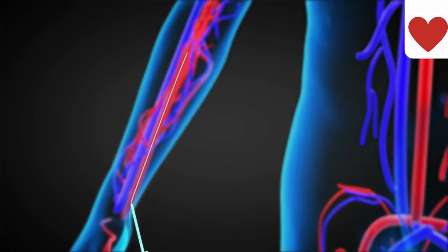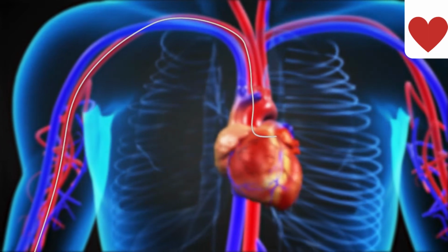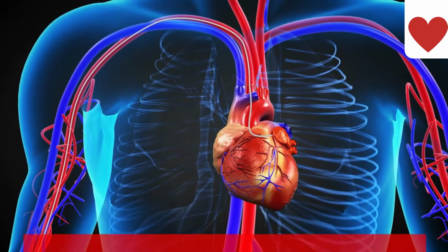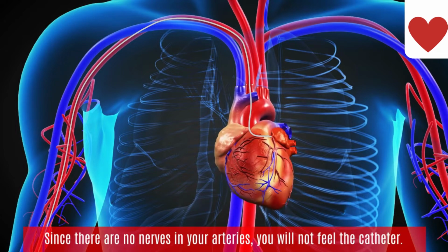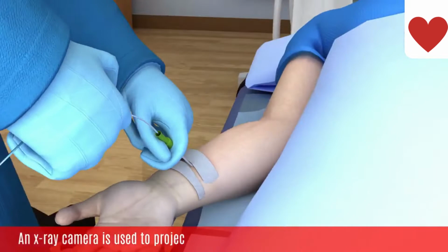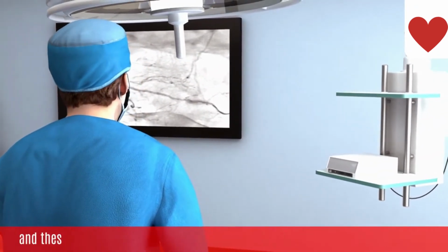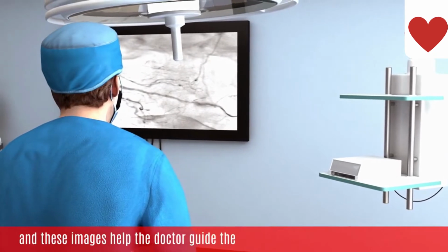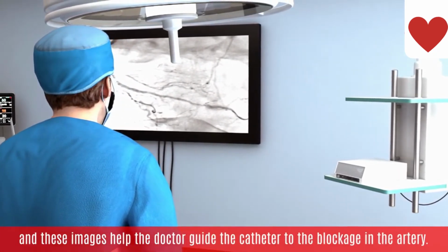From this access point in your leg or hand, a catheter is threaded through the arteries to your heart. Since there are no nerves in your arteries, you will not feel the catheter. An X-ray camera is used to project images of your arteries onto a television screen, and these images help the doctor guide the catheter to the blockage in the artery.